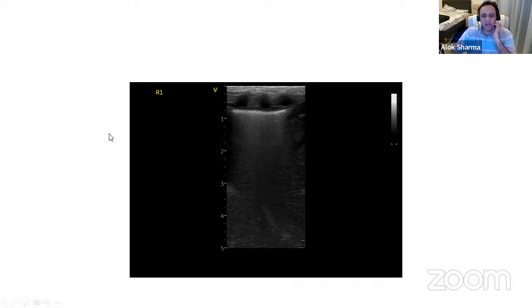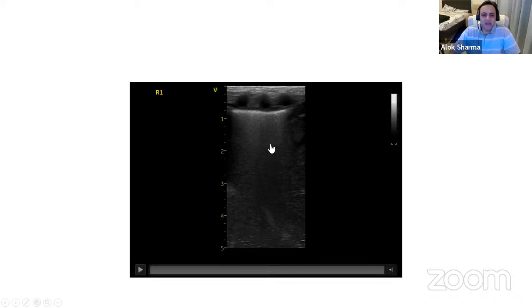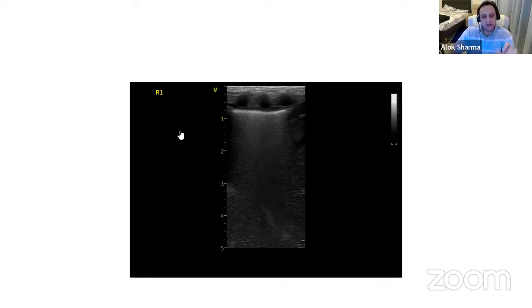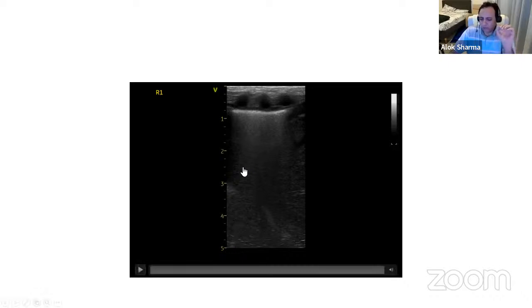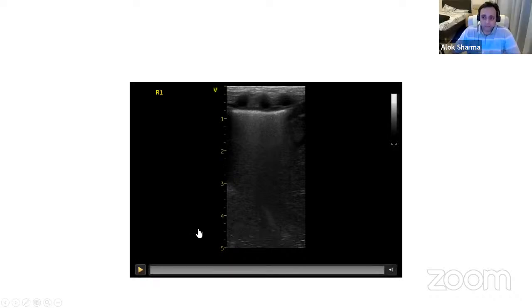And my only other comment is, is your focus on the right-hand side? Do you adjust focus in your machine, or what is the machine? Is it a GE machine? Yeah, so a GE should not need focus. But my gut feeling is just higher frequency and increased gain settings. And let's see what it's like when you do your next scan. Fine. But I think your interpretation is absolutely correct.